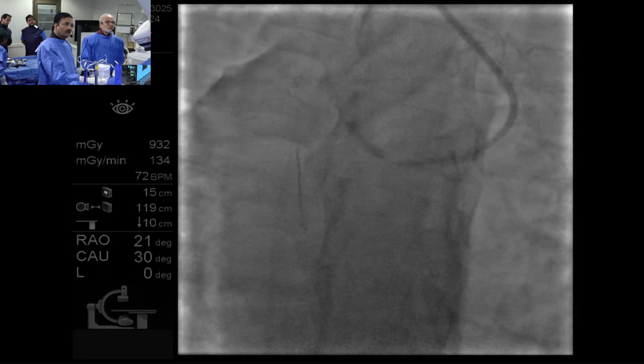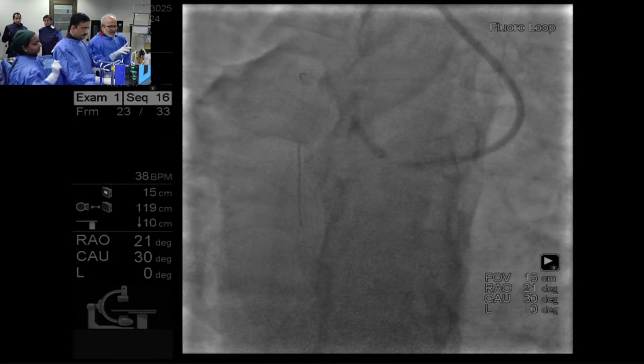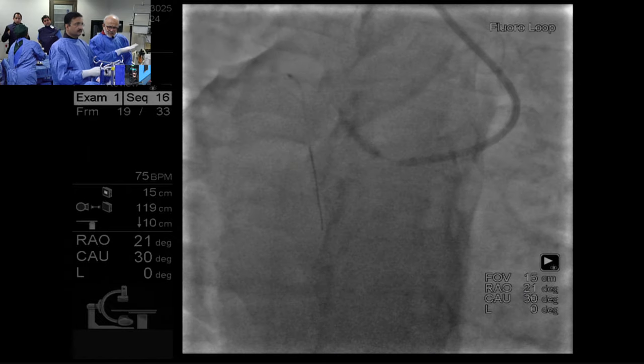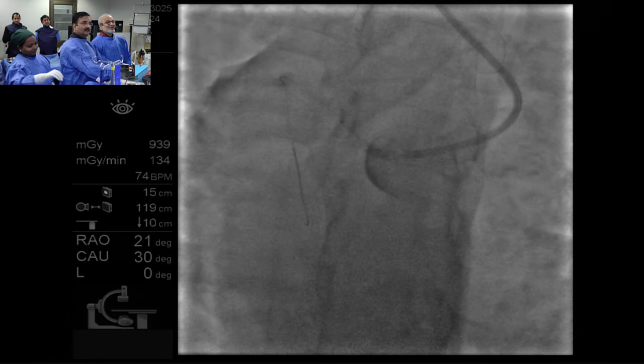Would you keep a couple of pulses back and take an injection and then deliver, or do an imaging and deliver, or would you exhaust them? All I see here, I have decided to completely finish those two nodules. Let us see what happens. Thank you.